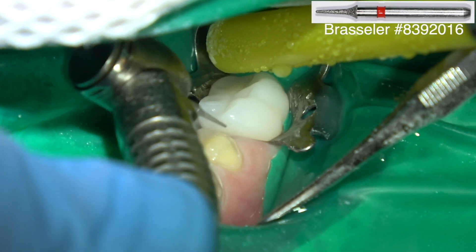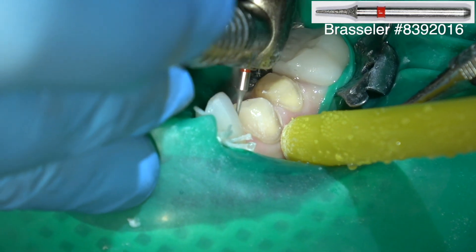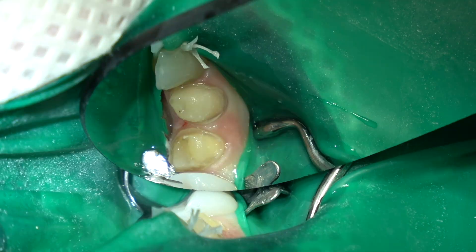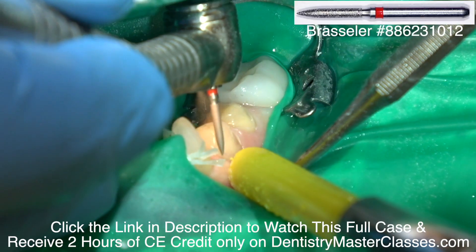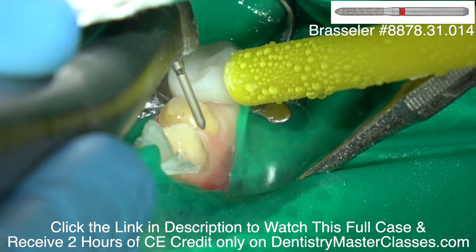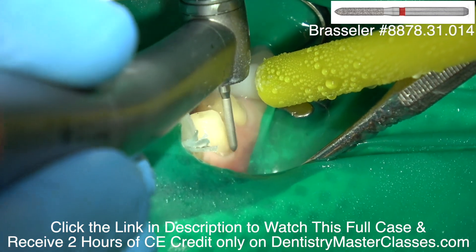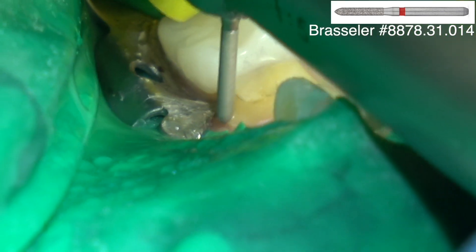This is a mosquito diamond to open the contact. I want to prep past the contact gingivally. I'd like to keep this supragingival if I could, but I want to break the contact. This is a flame-shaped diamond, and this is a small chamfer fine diamond, and I'm using that to place the margin. I want to place the margin about a half millimeter subgingivally.